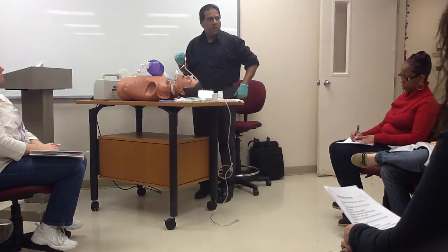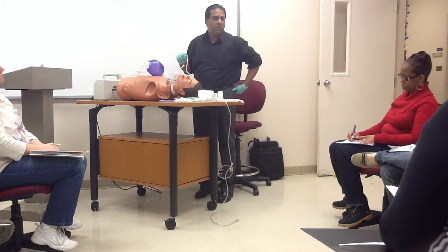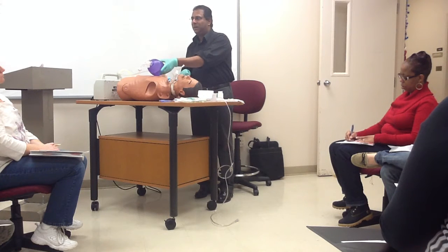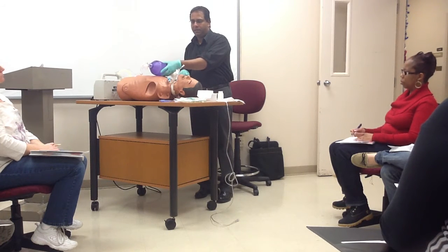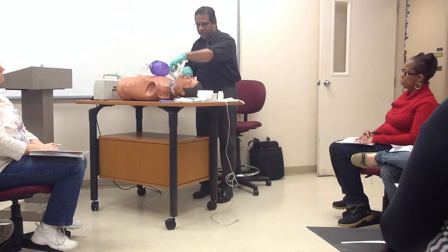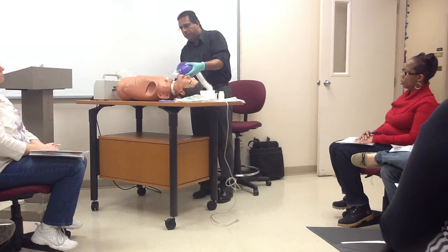Wait a minute. If you don't have your ambu bag all set to go, you are really screwed, because you have to set this down and go find your ambu bag, right? So that's why you already have your ambu bag turned on, ready to go by the bedside. Now, you are silencing the ventilator, taking the patient off the ventilator. You are hyperoxygenating the patient.